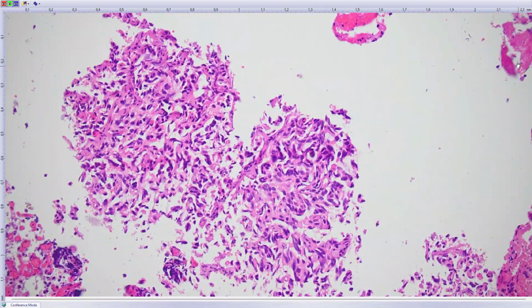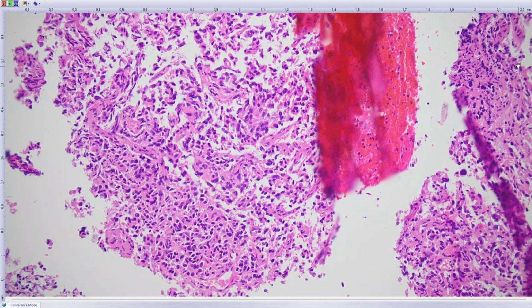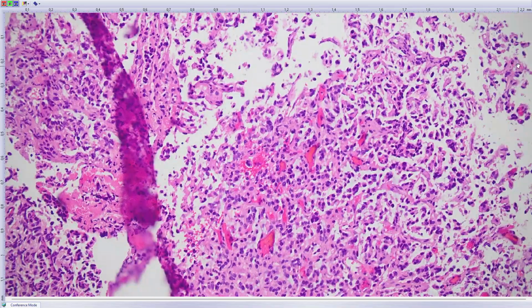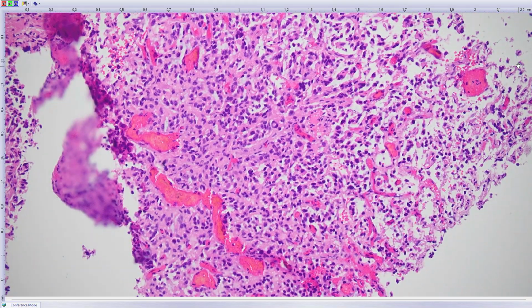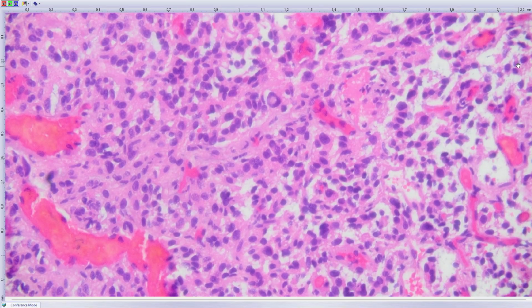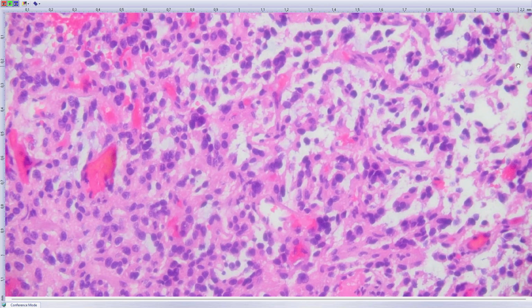And again, we have performed methylation profiling, and the diagnosis is high-grade glioma with piloid features, which are not present at all microscopically. So this is still quite a new entity, and we still didn't have the chance to appreciate the whole morphological spectrum of the tumor type. So it's quite important to have methylation profiling in tumors like this.